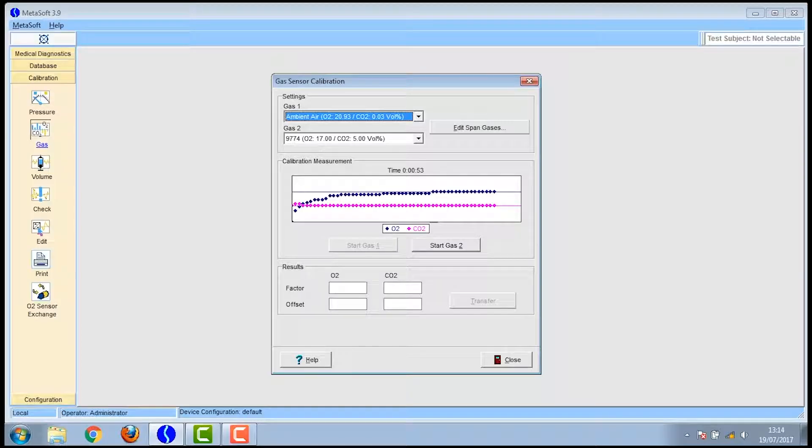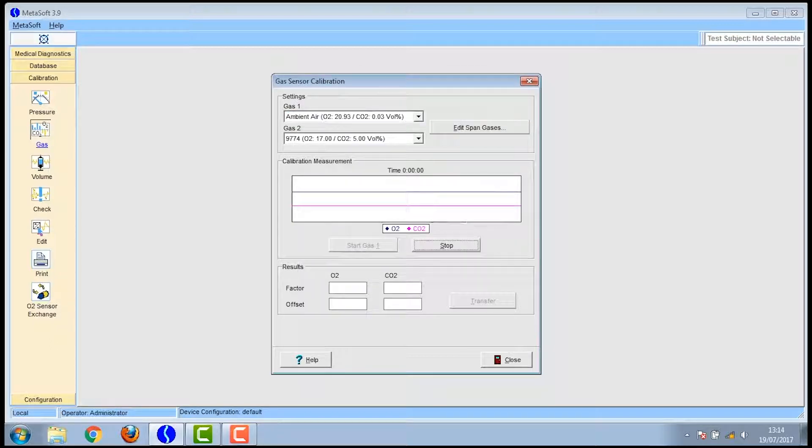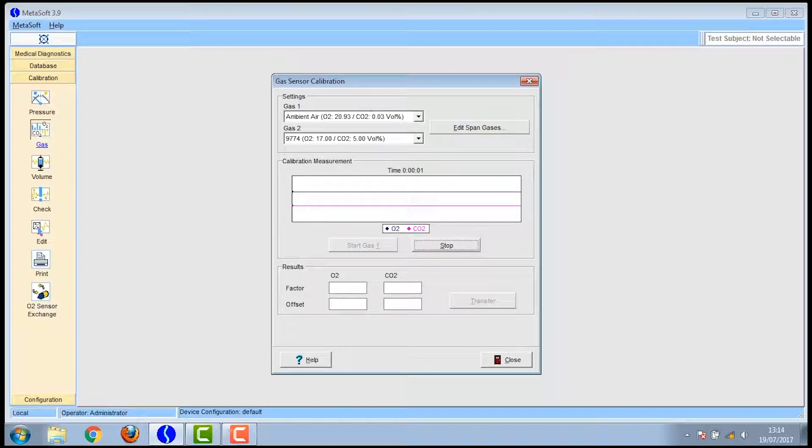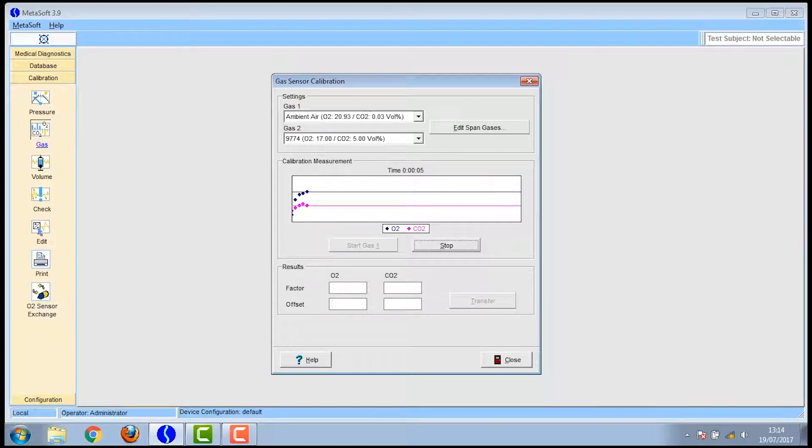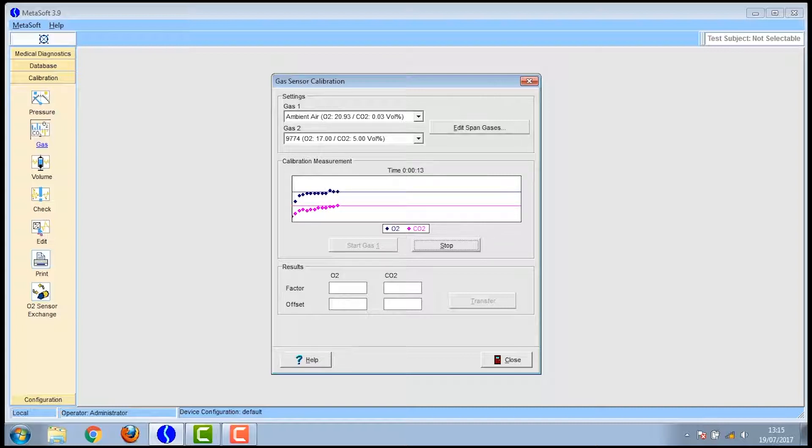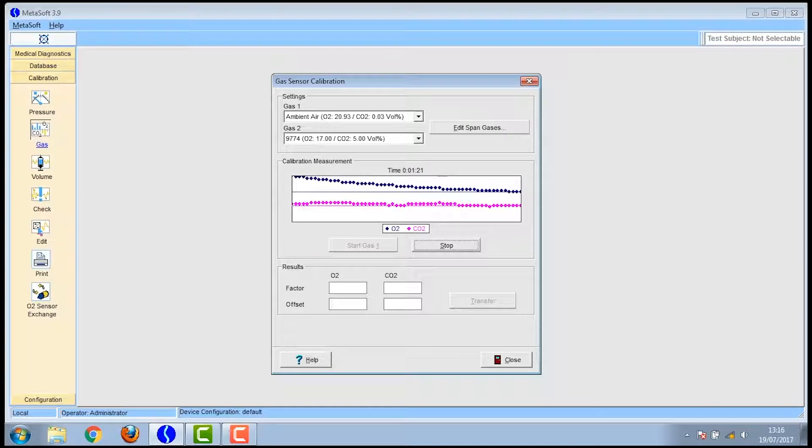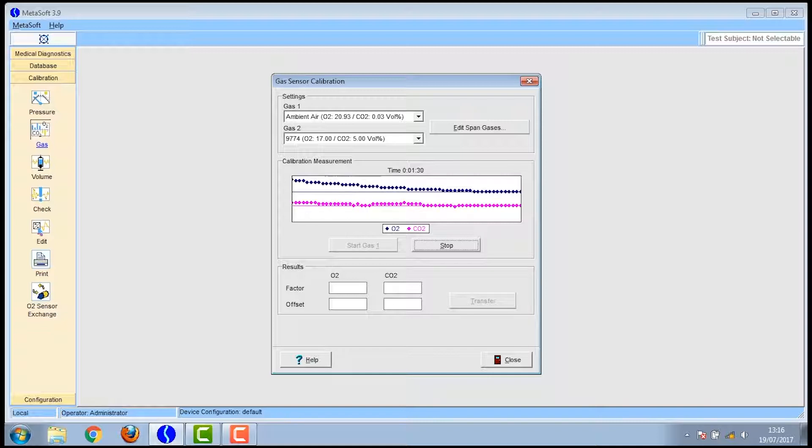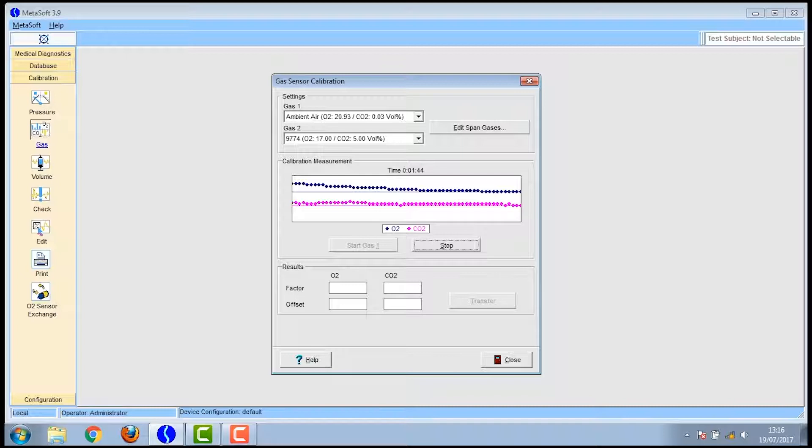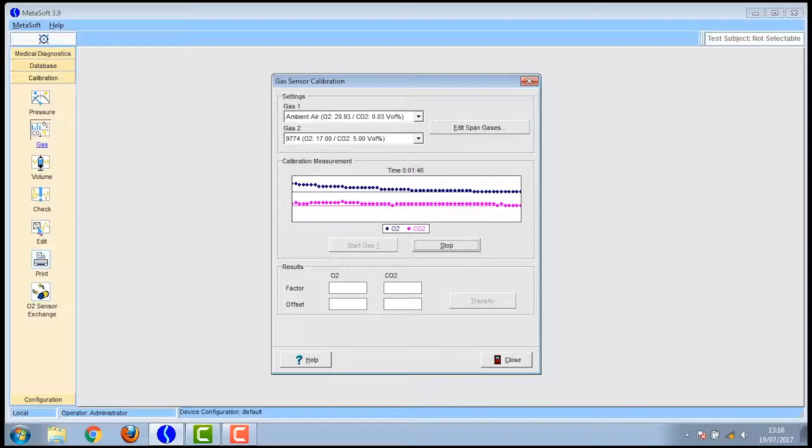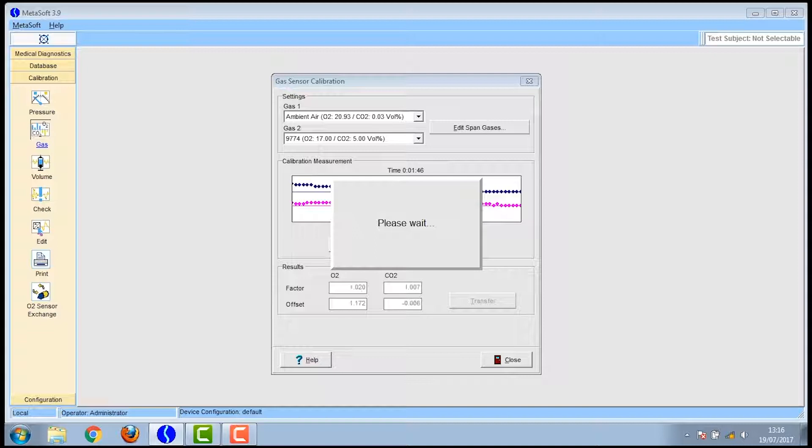The same process as before will occur with the lines going across the screen. This process can sometimes take quite a long time and it's just about being patient. Once the calibration is complete you click on transfer and then close the window.